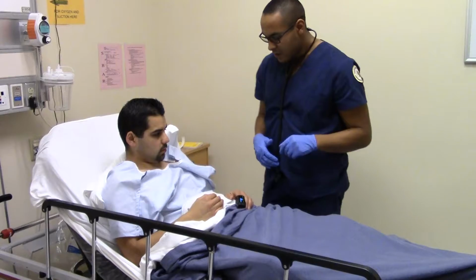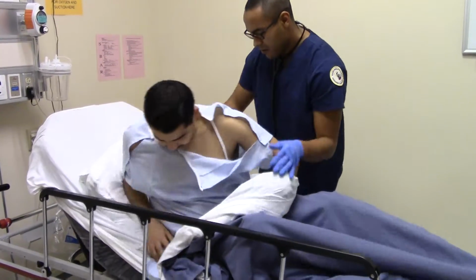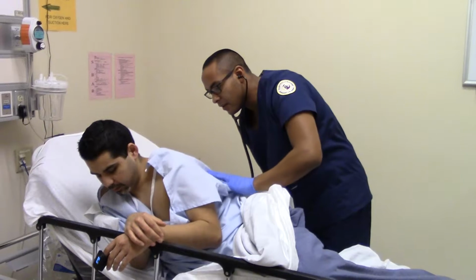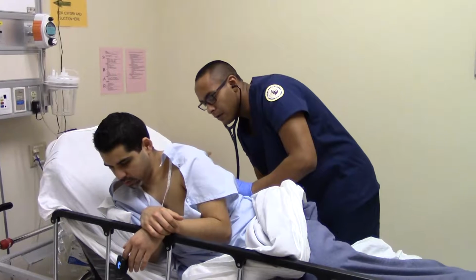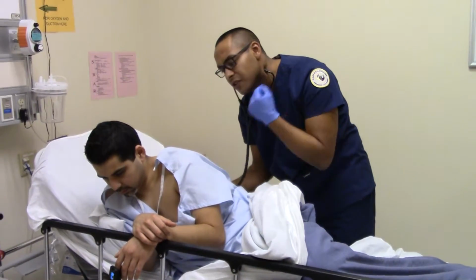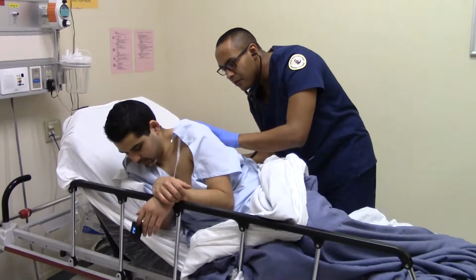Okay, Christian, I'm going to go ahead and sit you forward. Do you want me to pull the bed forward more, or do you want to just grab onto it? That's fine. I got it. Alright. Same thing. Go ahead and breathe in. Do you feel any dizziness right now, Christian? Let me know if you do. I'll stop. Go ahead, breathe in. One more time.